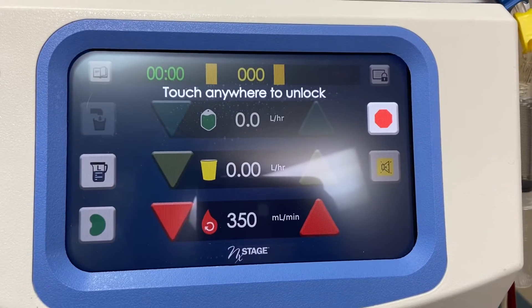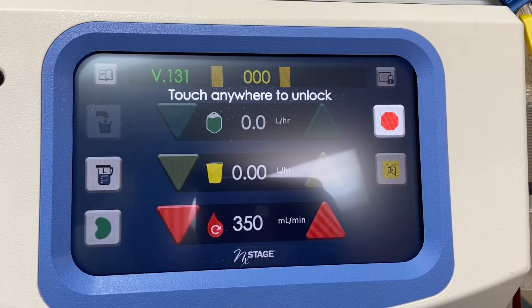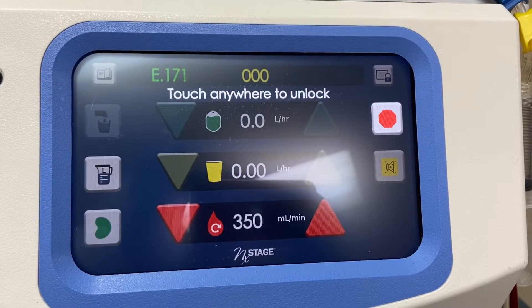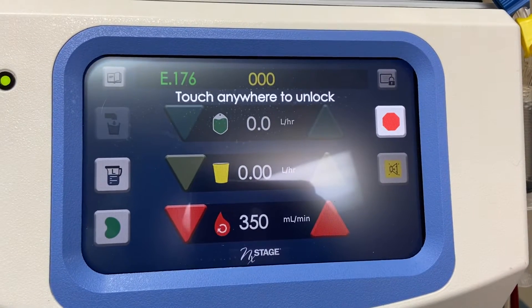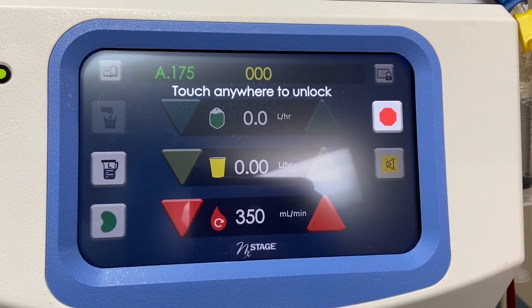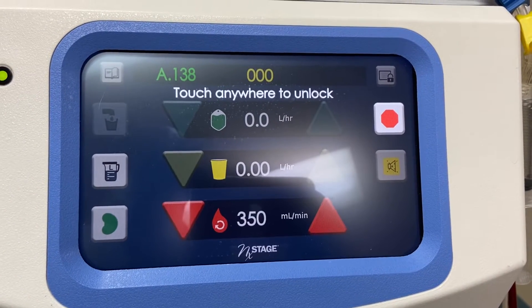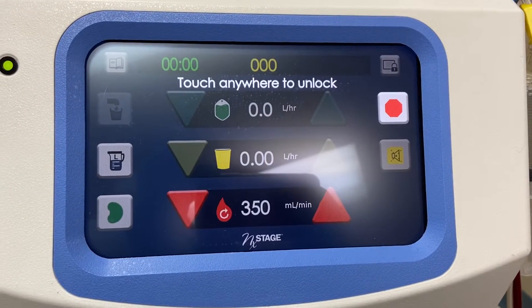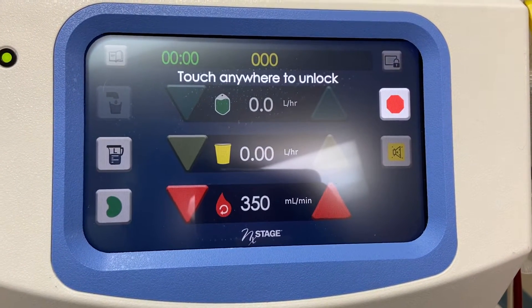Hello, this is how you return your blood by closed technique when you're using the Next Stage Cycler. So once the treatment is complete, you will see all zeros except for your blood flow.